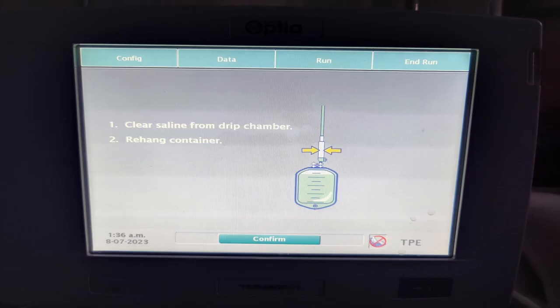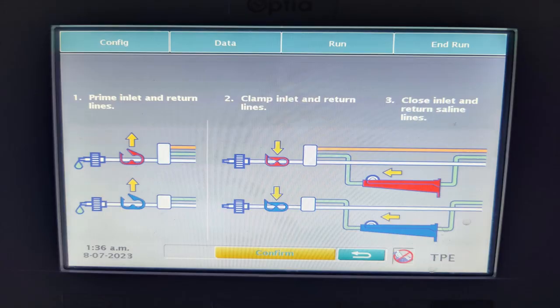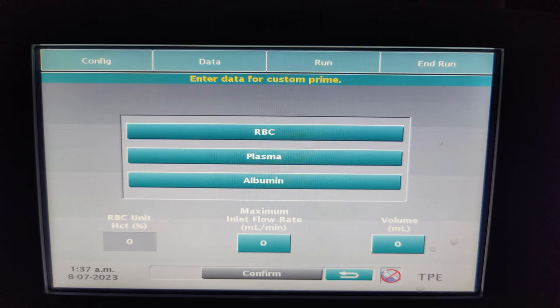Like any other plasma exchange, we have to clear the saline from the drip chamber in order to prime the inlet and outlet lines. The inlet and outlet lines will be primed as instructed by the system. Once this is done, the data for custom priming has to be entered.